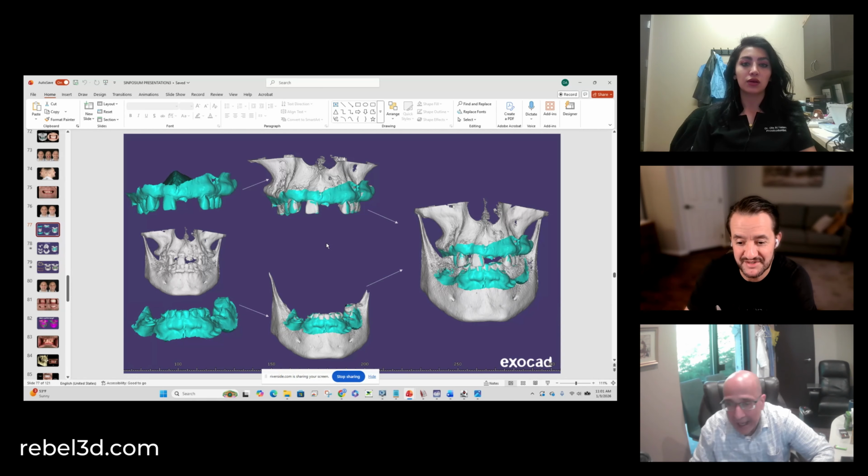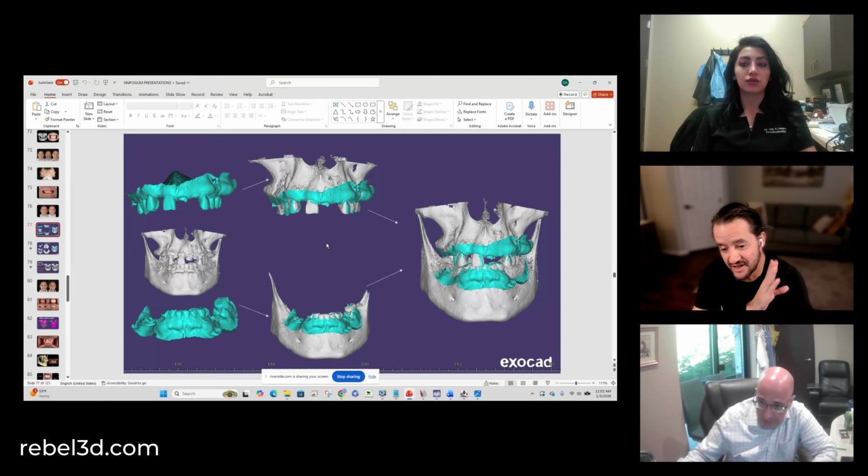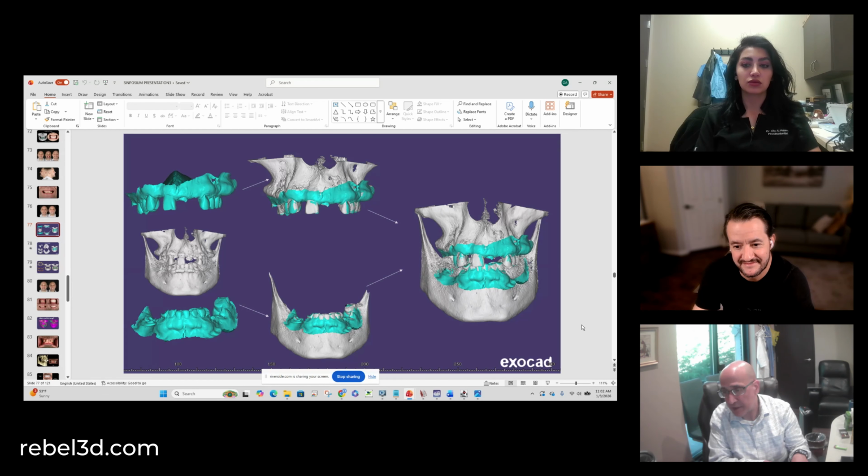That's a really interesting point. So you're still using your CBCT scanner from 5 years ago? Yes, with 175 micron tolerance. And you're getting excellent results. Excellent. If you imagine you're using the same thing now with today's CT scan that has 35 microns of accuracy, it's going to be a different scenario.